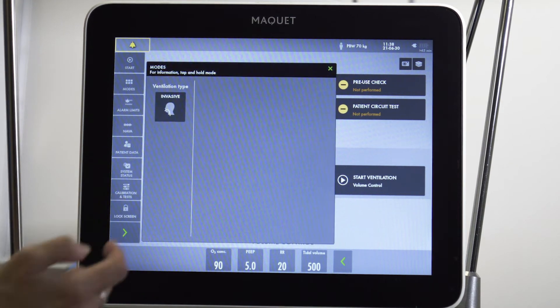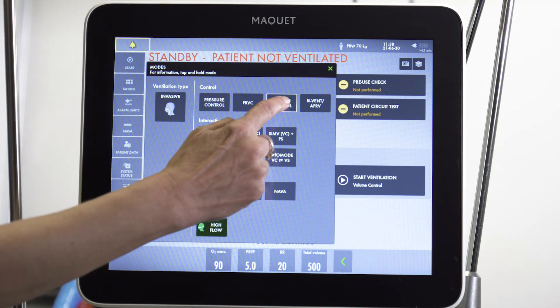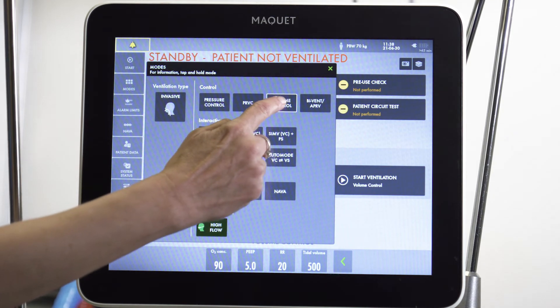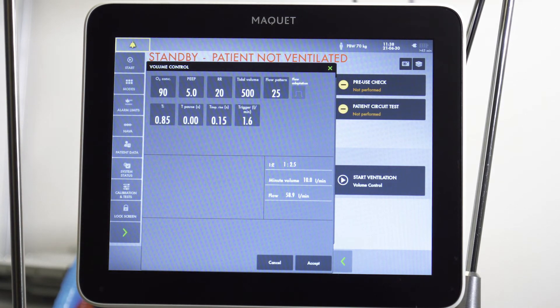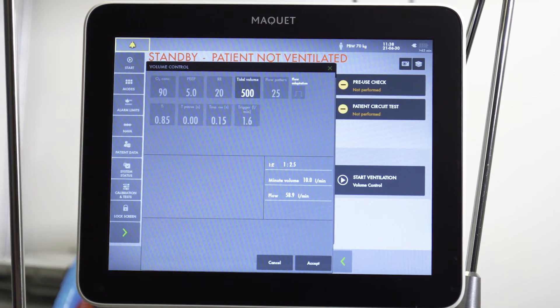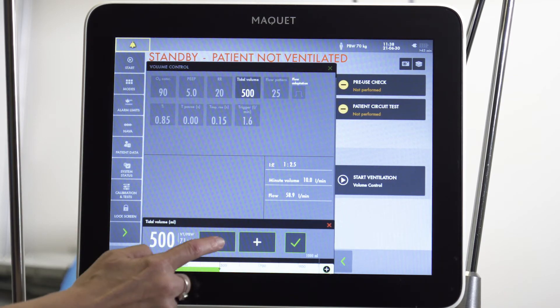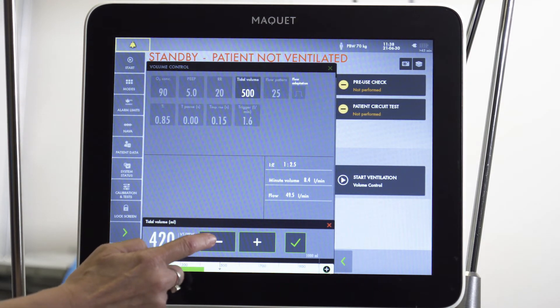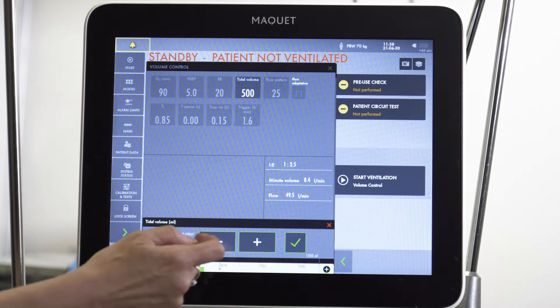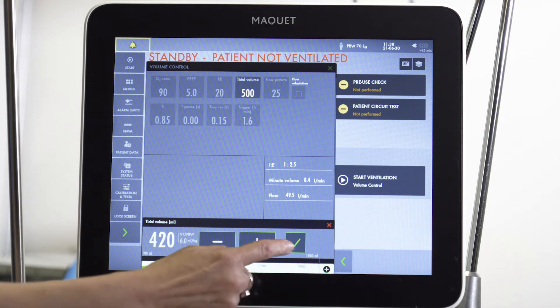We're going to use volume control, and we want to use a tidal volume that's lower than normal. In a 70 kilogram male, that tidal volume would be 420, which would give us a tidal volume of approximately 6 milliliters per kilogram of ideal body weight.